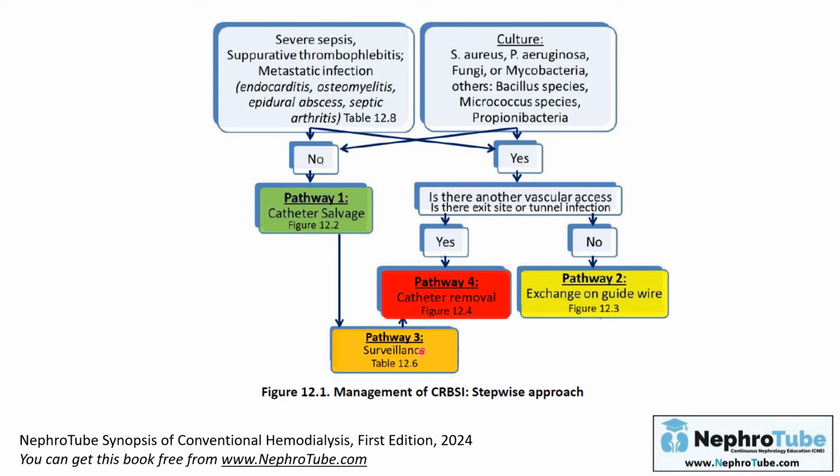If not, we can try a pathway called exchange over guidewire. From it, we will go to the surveillance pathway. Let's take each pathway and talk about it.